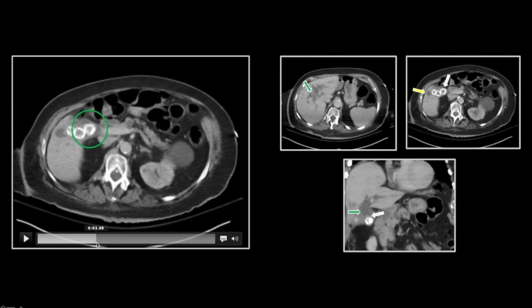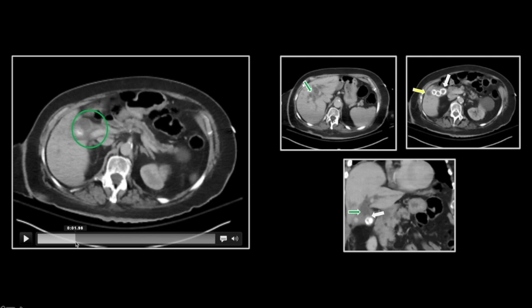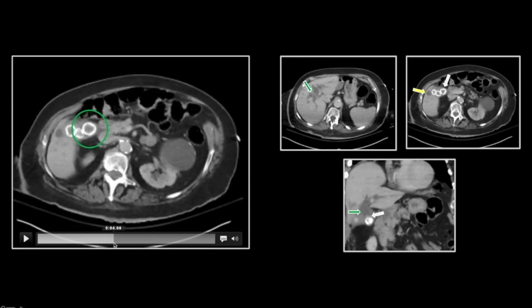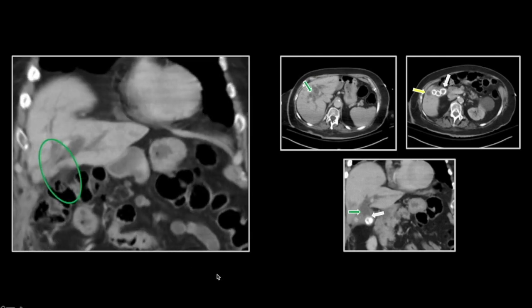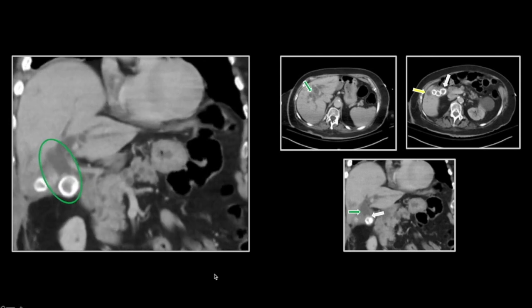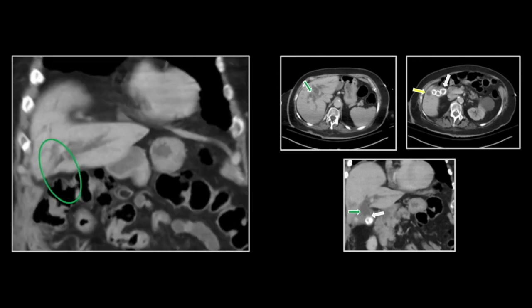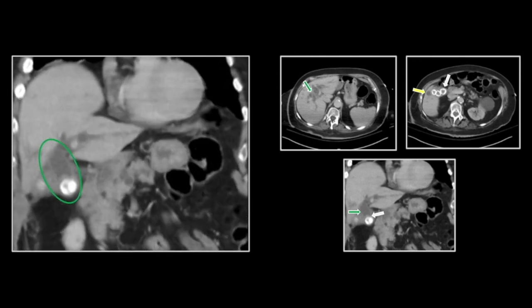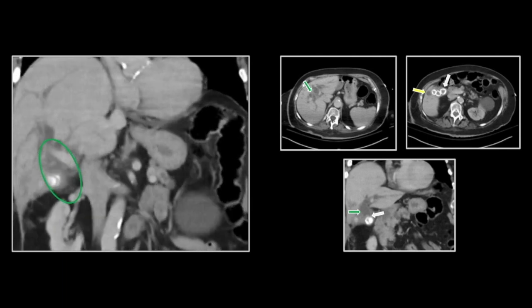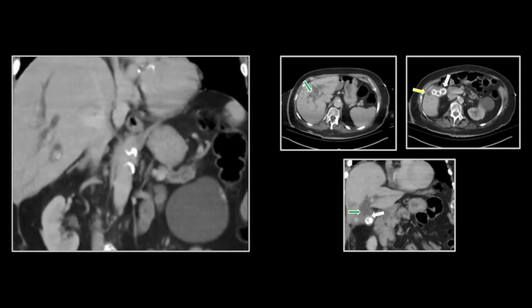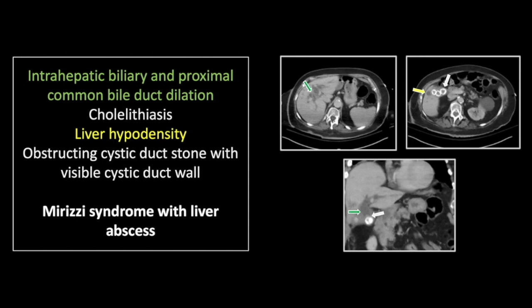Most importantly, there is a soft tissue layer surrounding that stone, showing that it is in the cystic duct and is in fact pushing on the posterior aspect of the common hepatic duct. That stone in the cystic duct or gallbladder neck is pressing on the posterior aspect of the common hepatic duct, causing obstruction of that duct without being in that duct. On the coronals, the important thing to note is that soft tissue layer over the superior aspect of the most medial stone, showing that it is within the gallbladder neck or cystic duct. So that is a case of Mirizzi syndrome with an associated abscess in the right liver lobe.